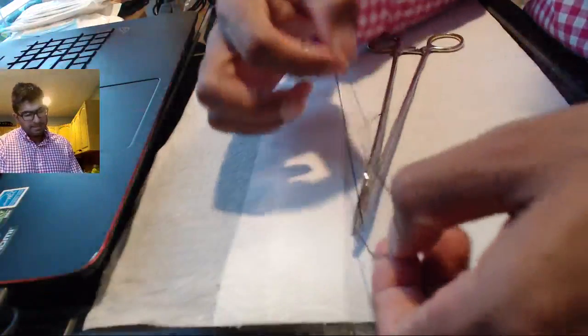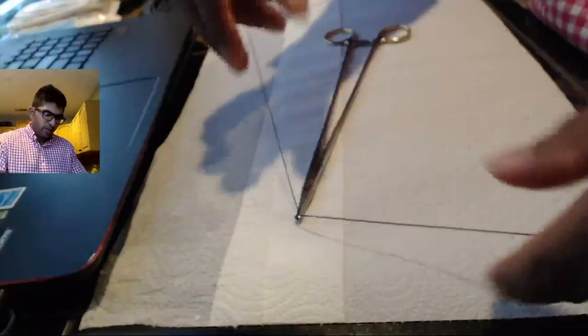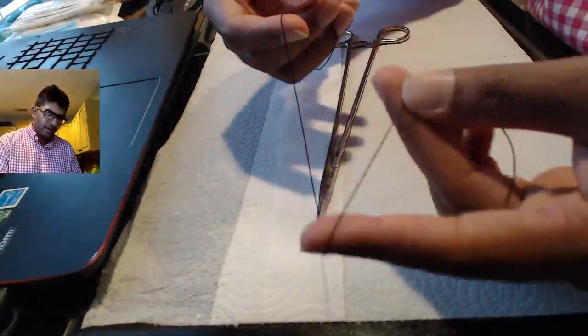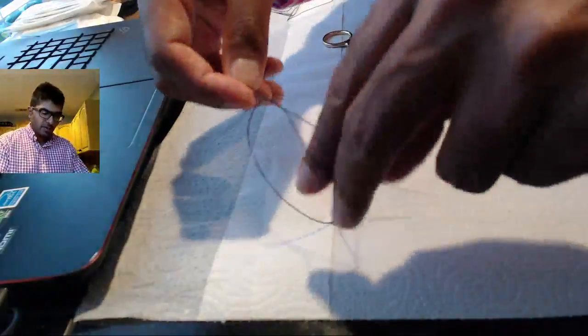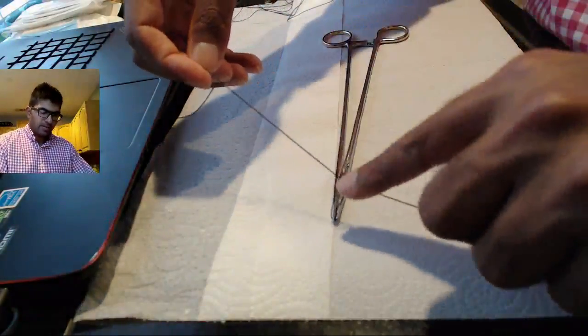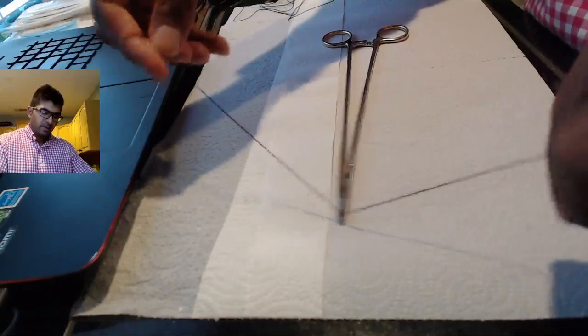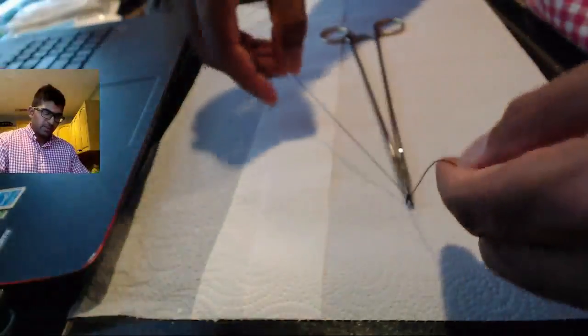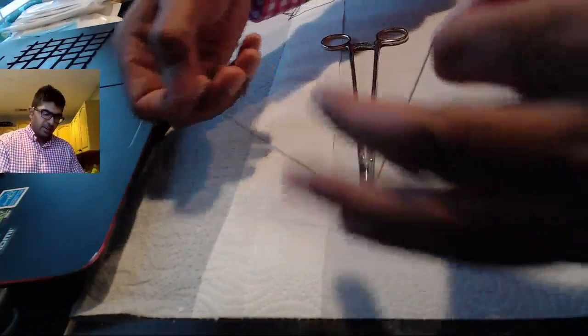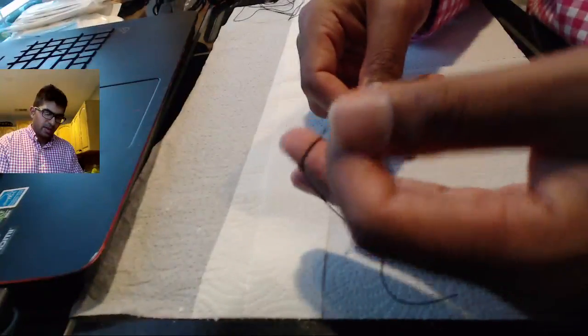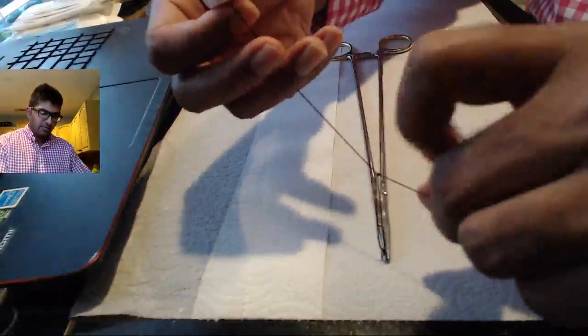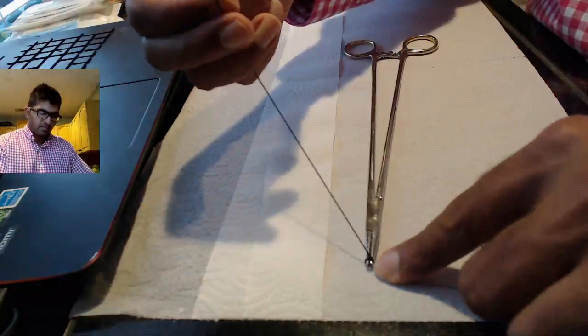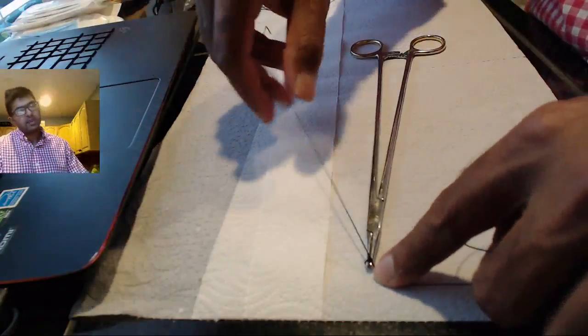Just to review, we're going back to the forehand, the middle finger, throwing a forehand knot, switching to the backhand. So watch that transition. I had it here. Again, index finger and thumb. And then using my middle finger to loop this around. And then knock down.